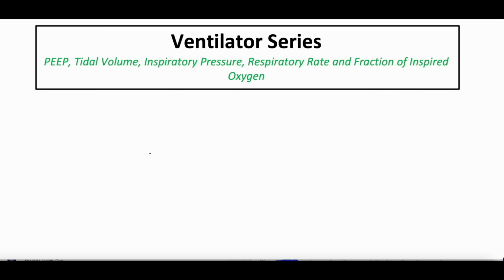So, introductory settings on the ventilator. Some of this is ventilator mode dependent, but let's just say you have a patient, stick figure person number 1, who unfortunately has a really bad pneumonia. So they end up on a ventilator. What that means is they have an endotracheal tube, right? It goes into their mouth, down into their trachea, and hopefully sits right in the trachea above the carina.